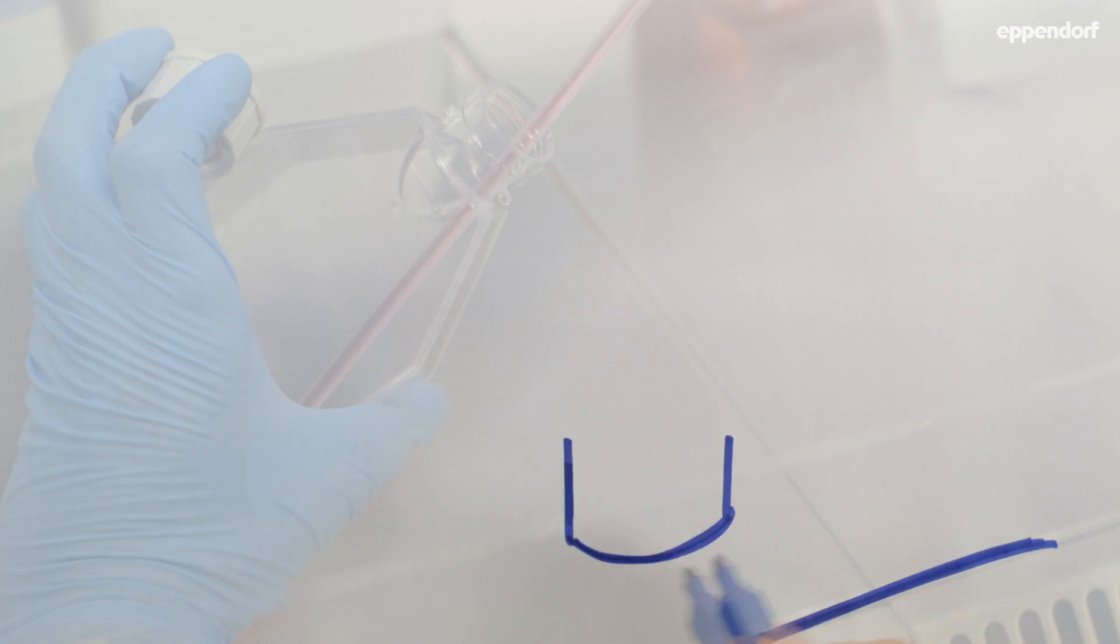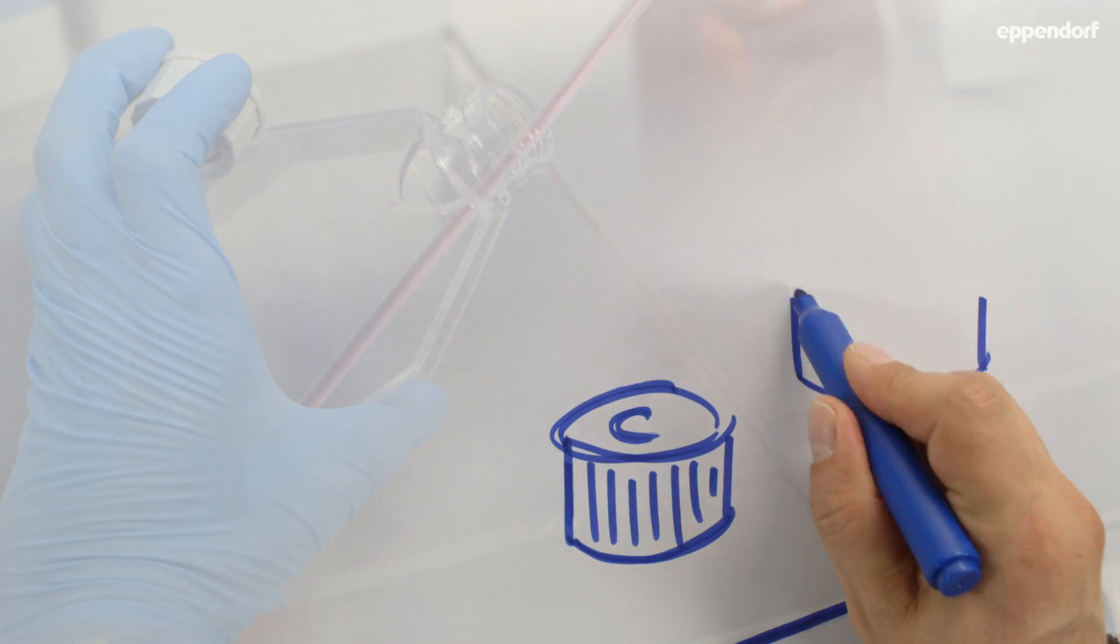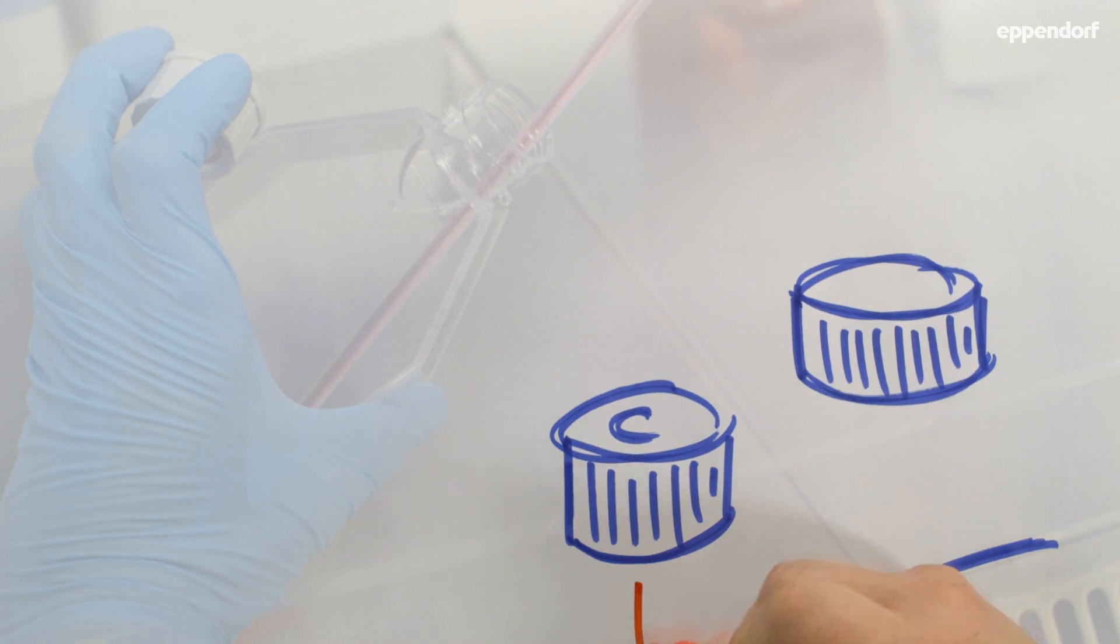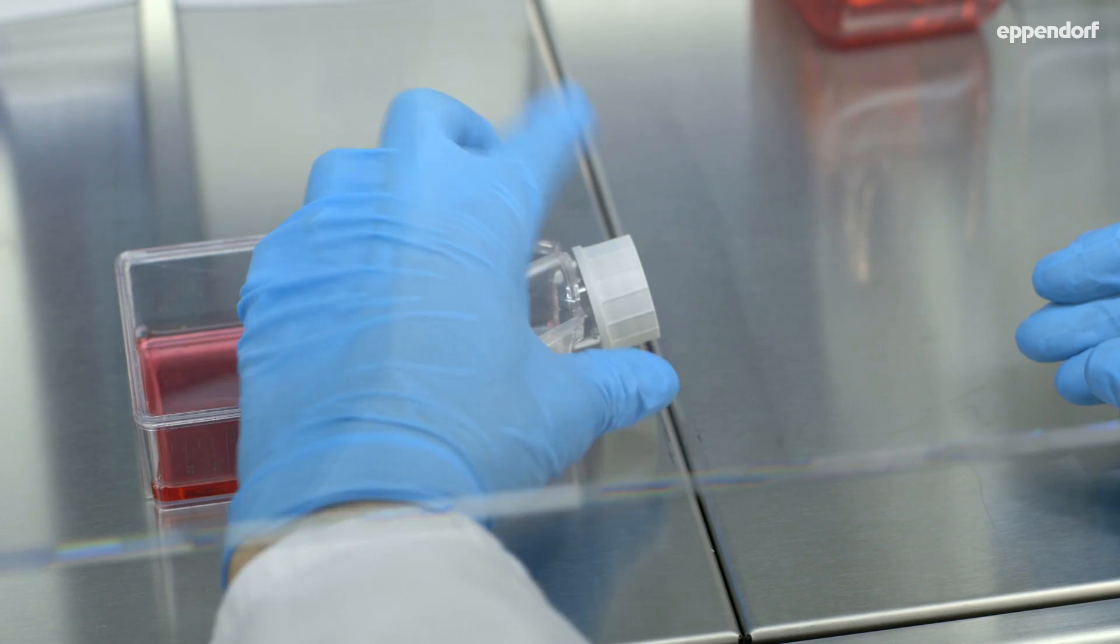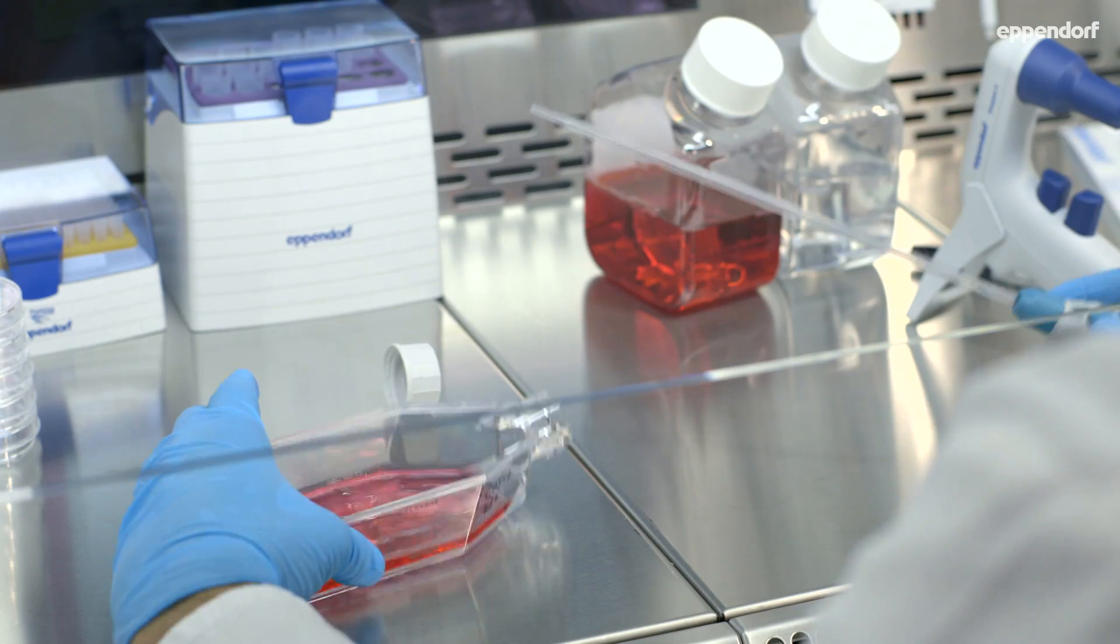Sometimes it is necessary to place the cap to one side. If the cap is placed inside down, sterility cannot be absolutely guaranteed. If the cap is placed inside up, airborne particles or droplets can enter the cap. By placing it onto its side, it is not in contact with the airflow or with the work surface.